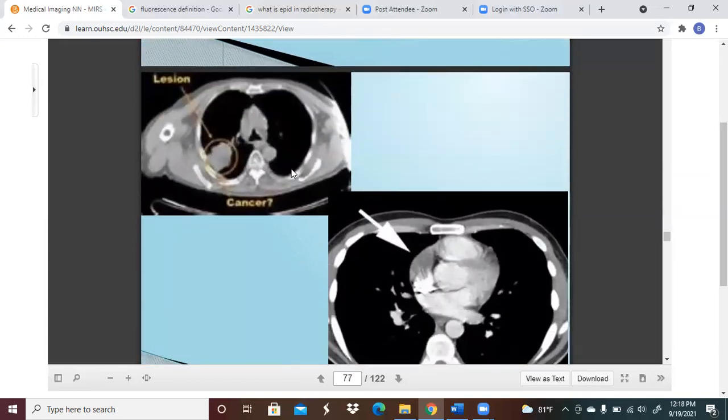Let's just show you some examples here. This is an example of a CT image. You've got one particular slice here where you can see something that's going on here. Could be cancer, could be something else. Generally, in my line of work, whenever I see something like this, I assume cancer just simply because by the time it gets to me, that's what they've pretty much classified something like that to be. Now, it could be other things.